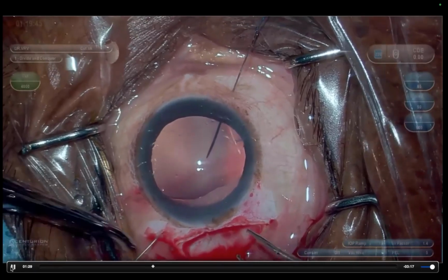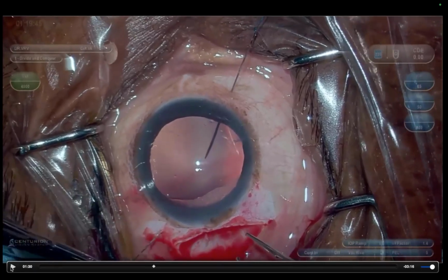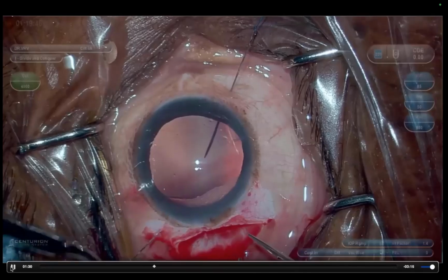When you're doing the sclerotomy, the most important thing you have to remember is you do not go parallel to the iris because we are so scared of going towards the retina. We tend to go a little parallel to the iris plane. Sometimes it might damage the ciliary body and cause bleeding. So you have to go perpendicular to the globe. That is how you have to go. Try to go towards the retina and then you will see that there will be no bleeding.